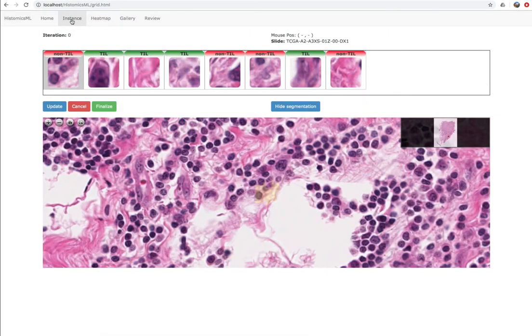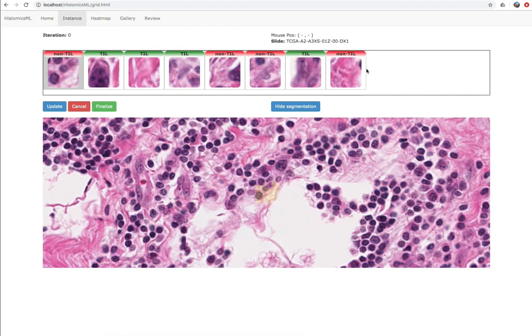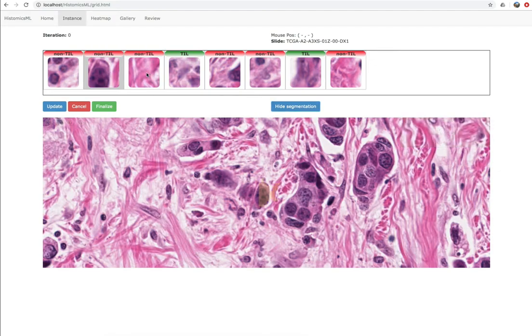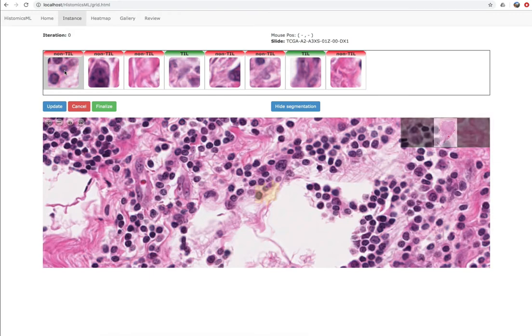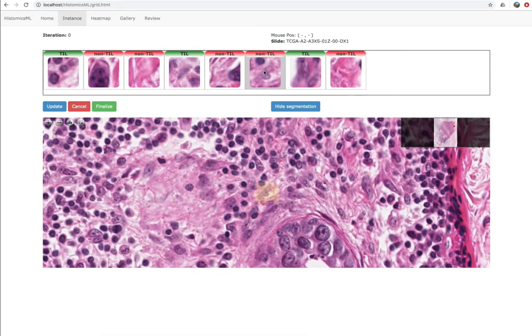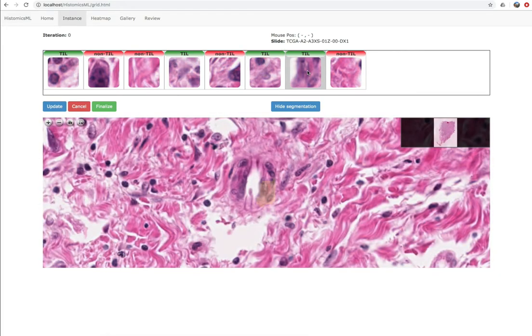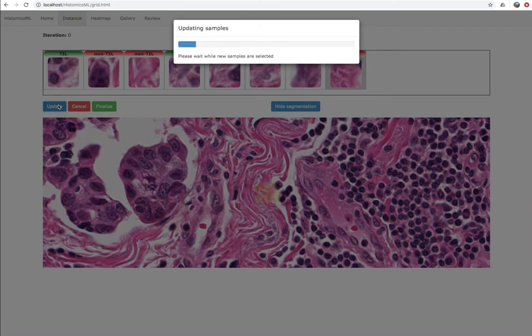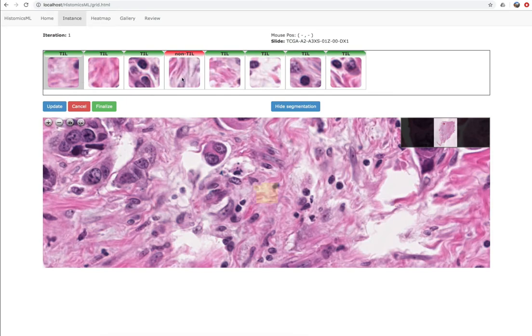In addition to the heat map labeling view, we provide a traditional active learning view where individual samples are presented to the reviewer for labeling. This menu can be displayed by clicking Instance on the banner. The instance menu displays a collection of eight superpixels with their predicted class at the top of the screen. Clicking on any one of these thumbnails will navigate the viewer to highlight that sample so you can see the surrounding tissue context. If the prediction is incorrect, you can switch the label by double-clicking the example. After reviewing the presented samples, click Update to retrain the classifier. After retraining, the classifier will examine the dataset and select another eight samples to present to the reviewer.